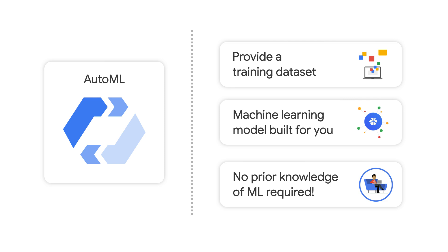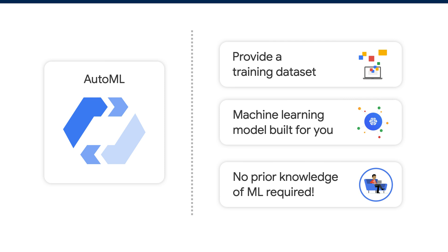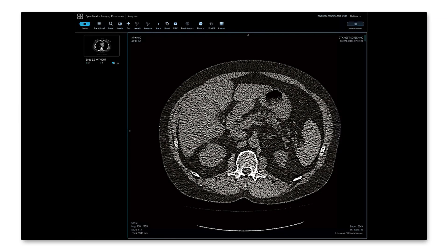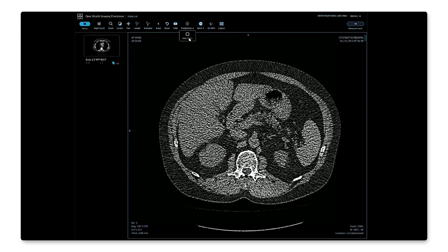Once AutoML finishes building the ML model, we'll get an online prediction endpoint that can be used to predict whether or not new images have spines in them. The final step is to use the OHIF viewer to view images from the Healthcare API DICOM store and use the online prediction endpoint to get our ML predictions. Here we have our image being shown in the OHIF viewer. Under predictions, we can click Find Spine to call the online prediction endpoint hosted on Vertex AI. And since a spine is detected, it is outlined with a box directly in the image viewer itself.